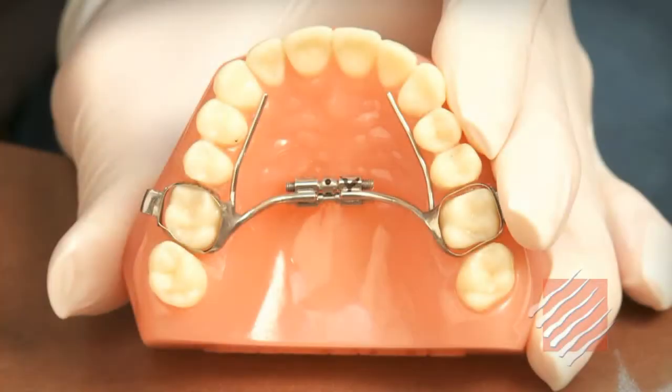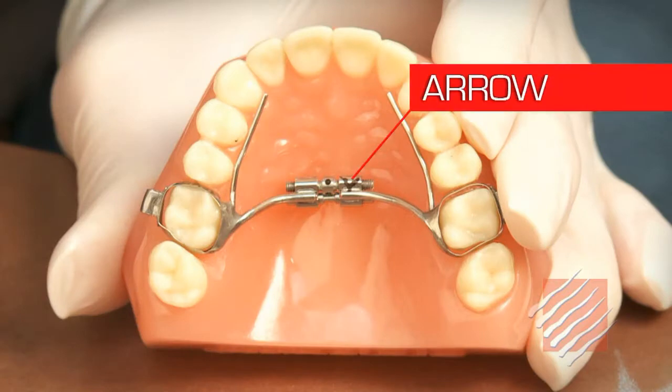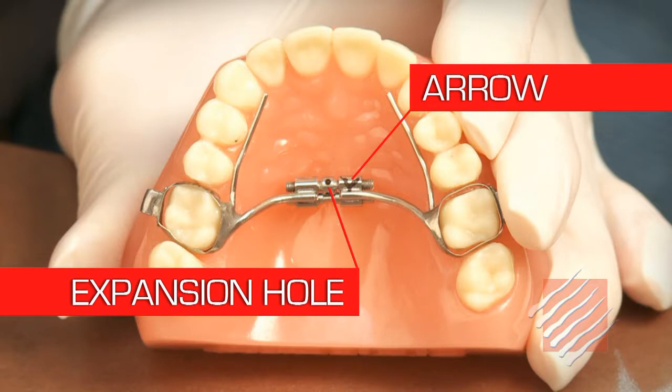Take a look at the expander, and you should be able to see a small arrow right here on the middle bar where the expansion hole for the key is located. The arrow simply indicates the direction the key should be pushed after it's inserted into the expansion hole.